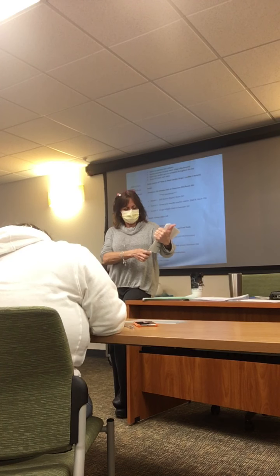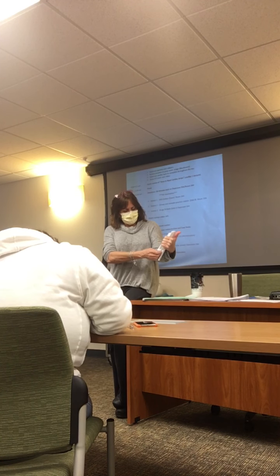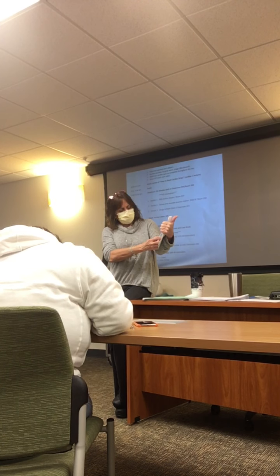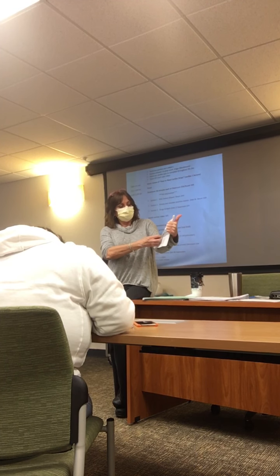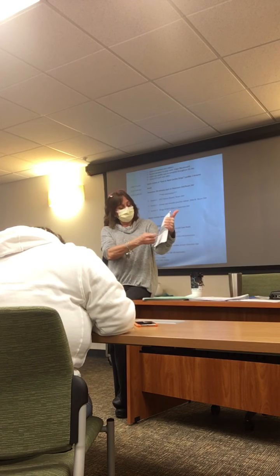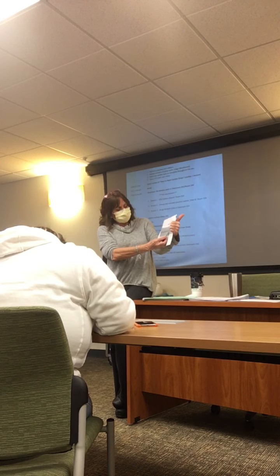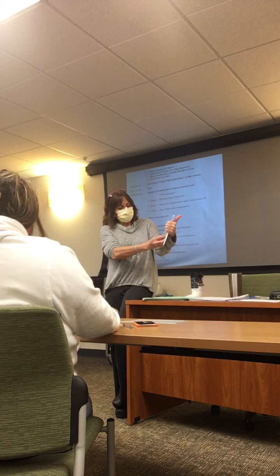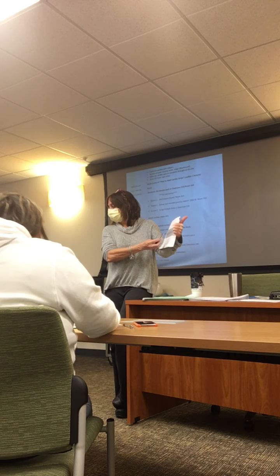Ventricular QRS complex. So I'm going to measure from the beginning of the QRS complex to the end, and this is the isoelectric line here. You'll hear it referred to where there's no upward or downward deflections. So I measure my QRS complex here. And what are you guys getting? How many little boxes are you getting in the QRS complex?